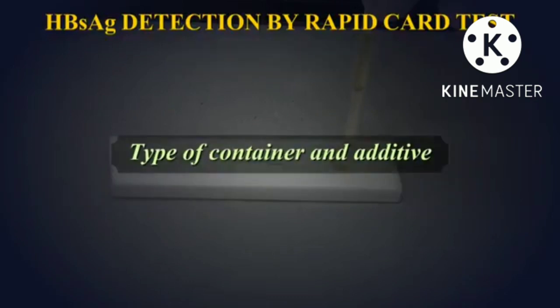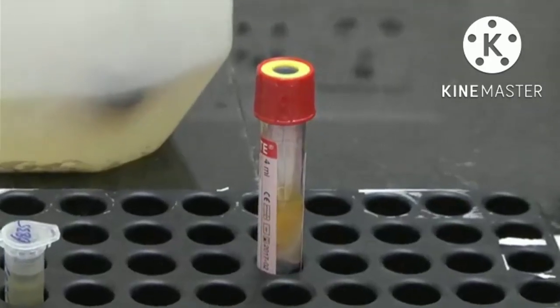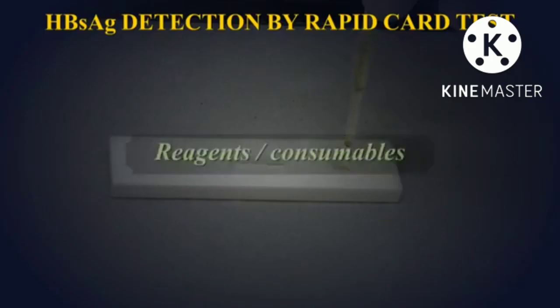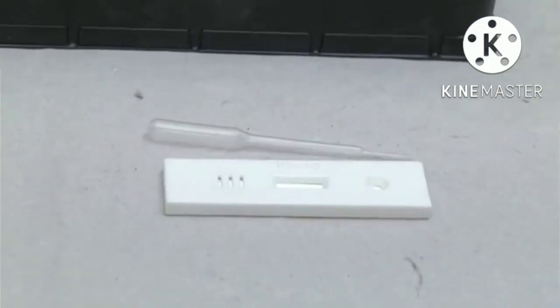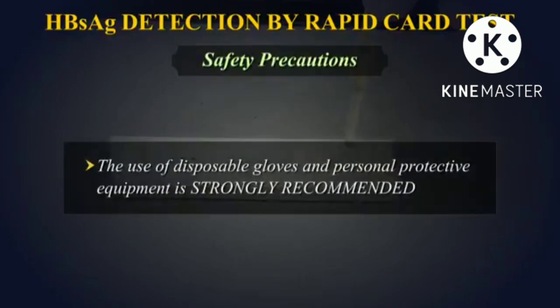Type of container and additive. Collect 2 milliliters of venous blood in a plain red-topped vacutainer. Reagents and consumables. HBsAg test device. Sample dropper. Safety precautions. The use of disposable gloves is strongly recommended while running the test.